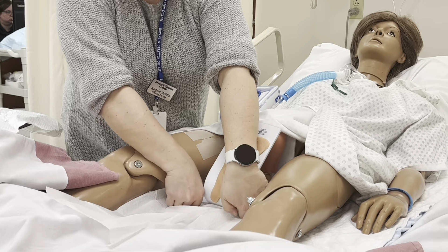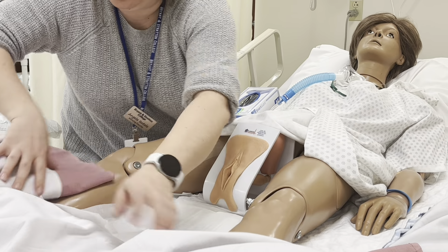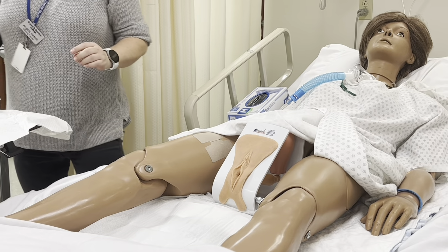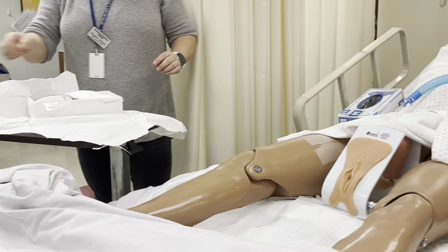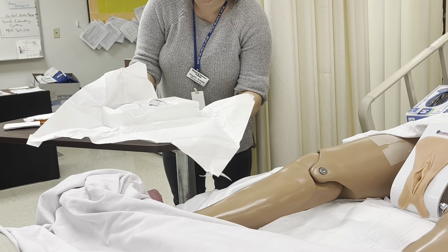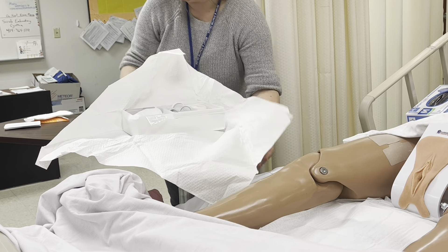Shiny side down, dull side up. I'm going to take out my gloves and take out this pad. I'll move my kit over so I don't contaminate my gloves.